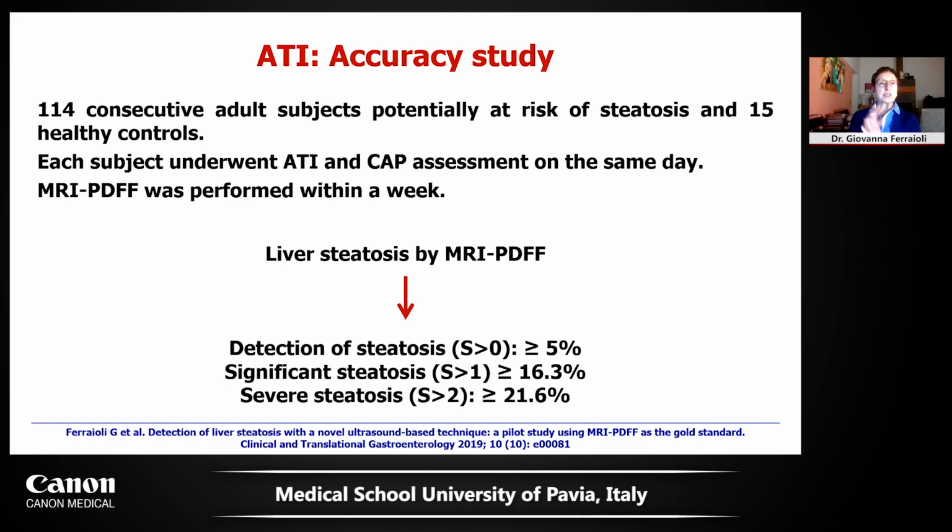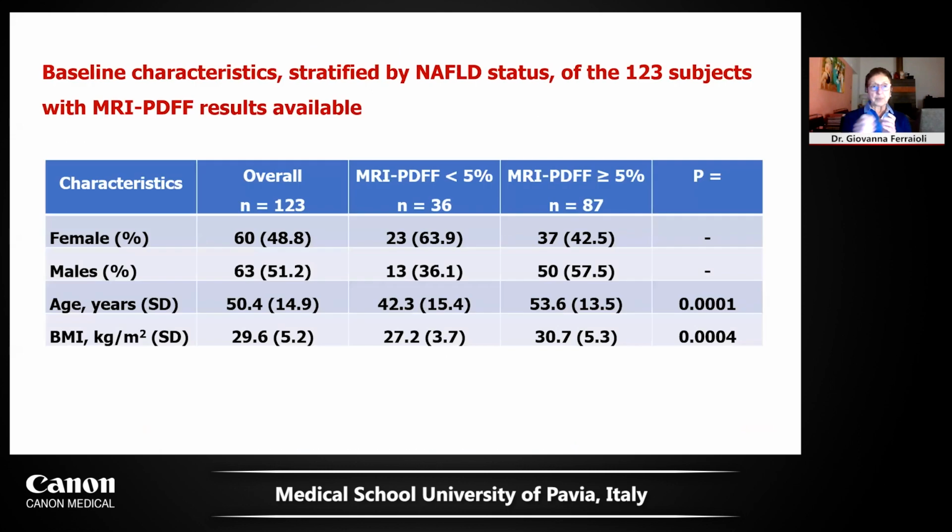And of course, the radiologist performing the PDFF was unaware of the results of ATI and CAP. And these are the values that we used for the PDFF for the detection and grading of liver steatosis.